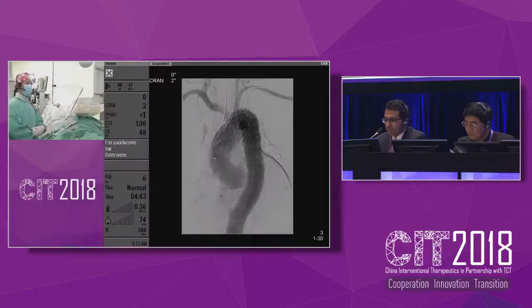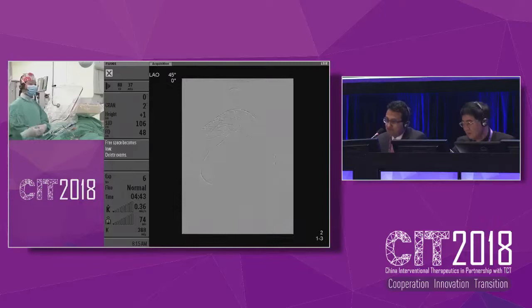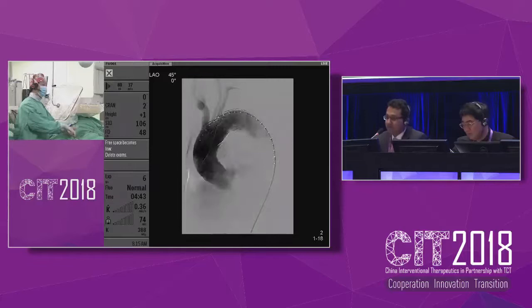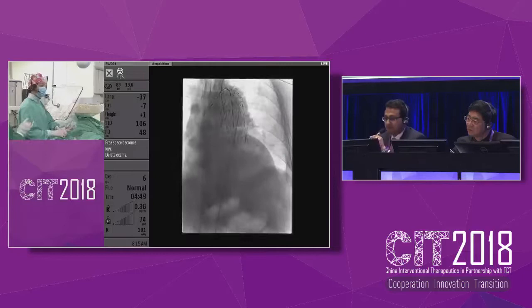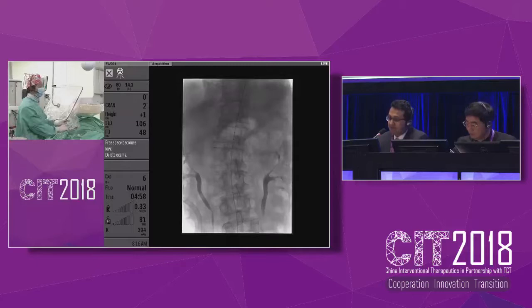I mean, is it mandatory? It's not mandatory in this situation where your ulcer is on the inferior aspect. However, it is probably related to the isthmus, as they pointed out, and that's usually right just beyond the subclavian origin. So there's a theoretical risk that there's a persistent leak. It'll be a judgment call as to how it's handled here. It'd be interesting to hear from others in the panel about other technologies. There are now fenestrated devices that are custom made for patients, under IDE exploration in the United States and Europe, where CT scans are used to make custom grafts for patients just like this.